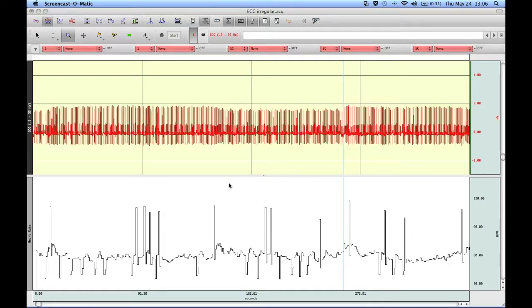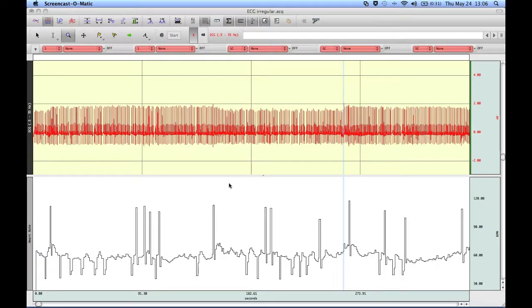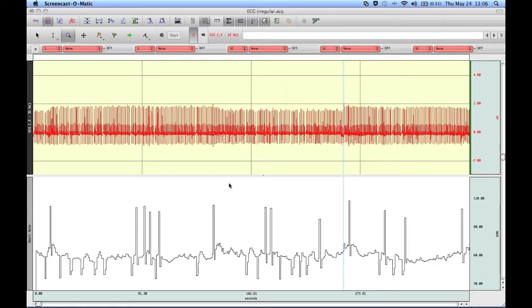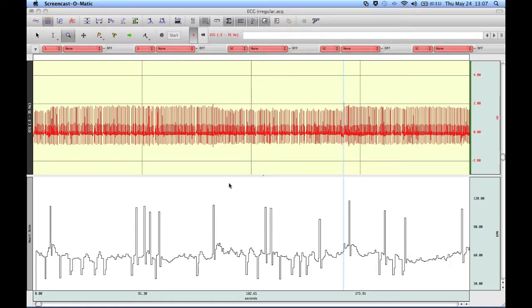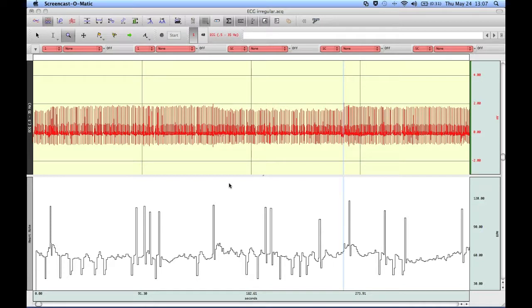As we've seen with the previous casts, the Fine Cycle Peak Detector has many uses, and this particular feature, the clustering output, allows you to take advantage of yet another piece of the Cycle Detector functionality. Clustering allows you to locate or divide your data into groups, and the clustering of the groups is learnt within the software. The algorithm being used is a k-means cluster algorithm, and the software will allow you to select the number of groups that you want to break your data down to.